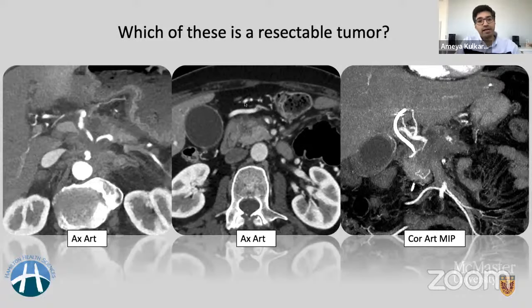CT by default has shown a very high kappa value when it comes to correlation between the imaging findings like this and the pathologic characteristics of the tumor. Plus, CT is very widely available for use, and there are many studies which talk about comparison of CT and MR when it comes to assessing local extent of pancreatic tumors, and that's why it is really important to discuss CT in performing preoperative assessment.